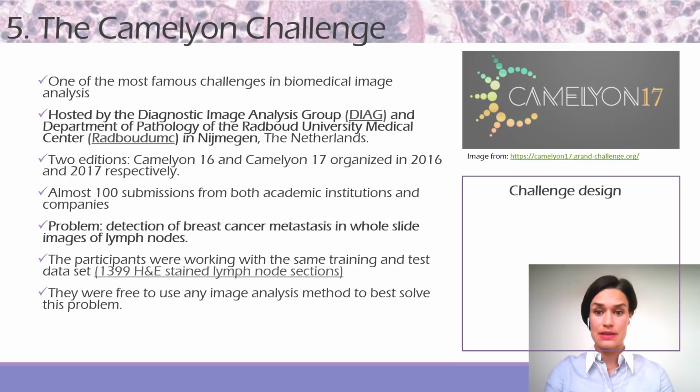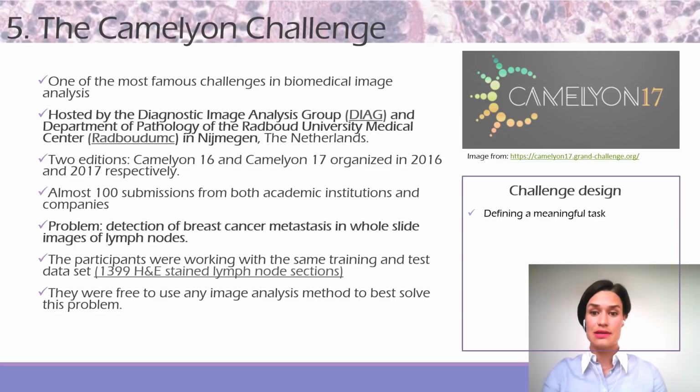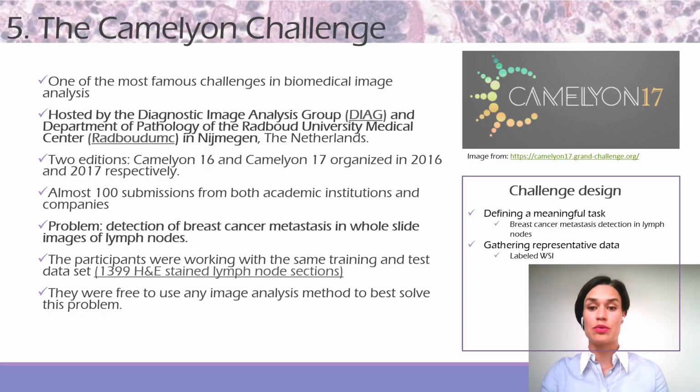This is how the challenge is designed, not only the pathology ones, but the other ones as well. Meaningful tasks need to be defined. In this case, that was breast cancer metastasis detection in lymph nodes. Representative data needs to be gathered. In this case, it was labeled whole slide images. A reference standard needs to be defined.